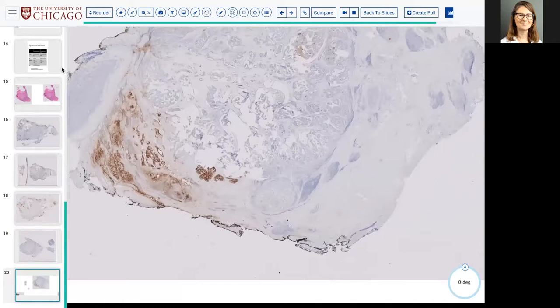So one, it's not a follicular derivation, which you can tell by the PAX8, TTF1, and thyroglobulin. So it will not uptake iodine. It will not be responsive. So yeah, this patient needs some kind of other treatment, perhaps an NTRK inhibitor.